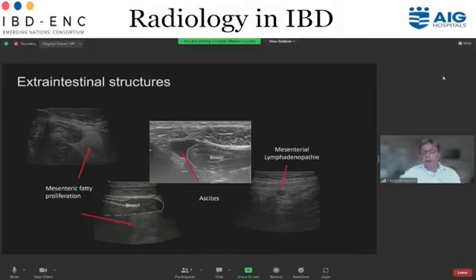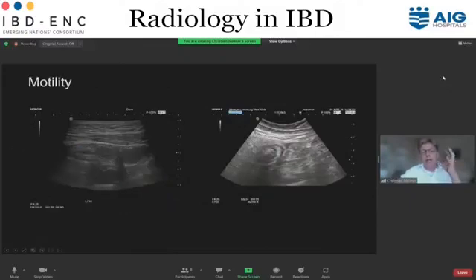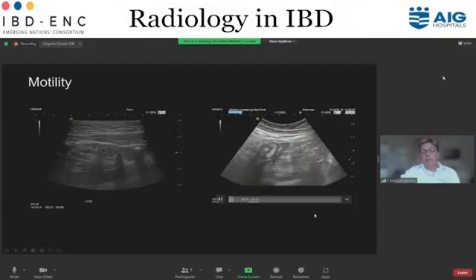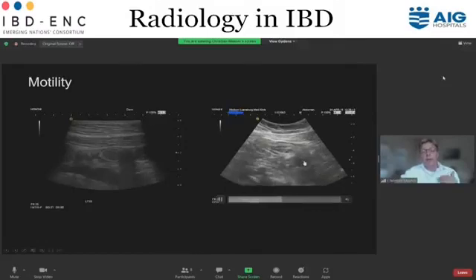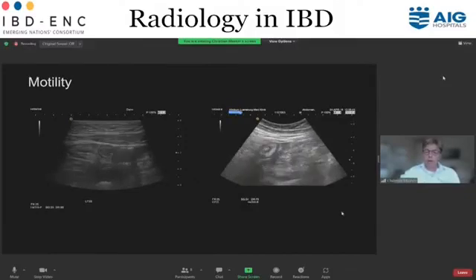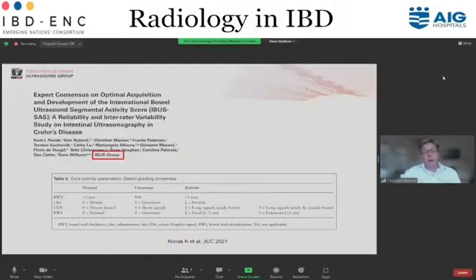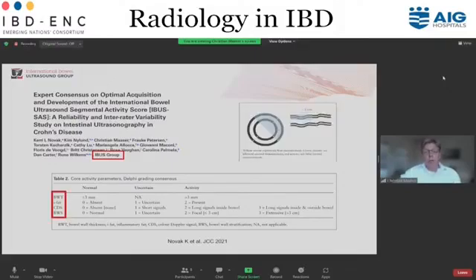You can also look for free fluid and lymphadenopathy, and then you look for motility. On the left is a normal terminal ileum with nice contractions. On the right is also a terminal ileum, but the movement you see is from the probe moving — the bowel itself is very stiff, with hardly any motility, as a sign of pathology. For more details, there's an expert consensus paper by the IBUS group published recently covering bowel wall thickness, the i-fat, color Doppler signal, and bowel wall stratification.